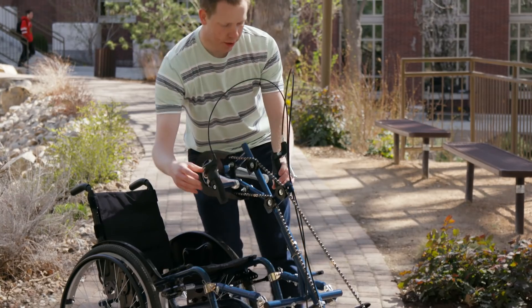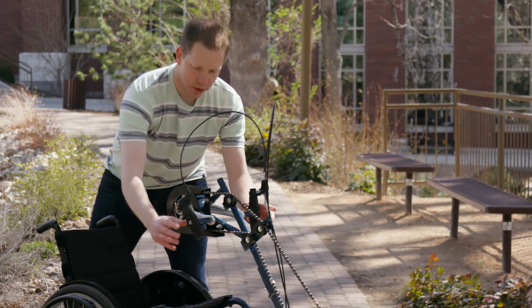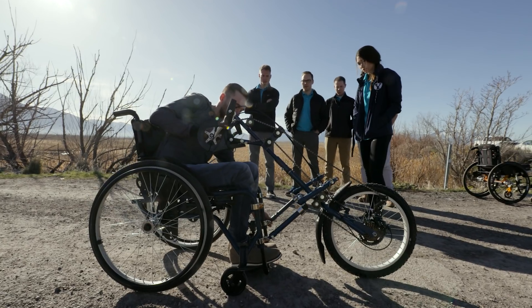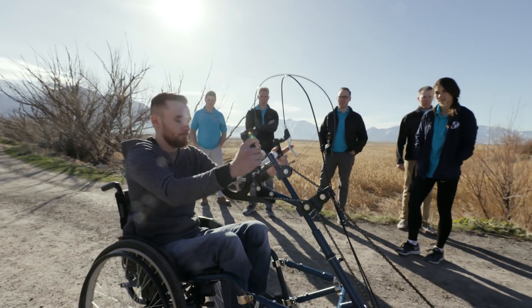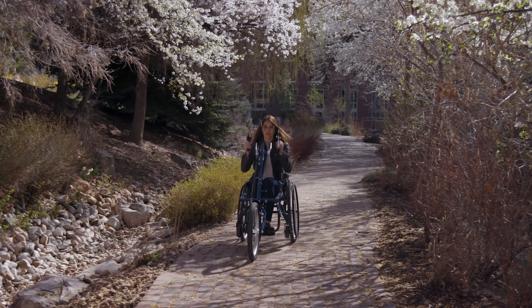You have your shifter and your brake right here, so while you're pedaling you can steer, shift, and brake all at once. There are seven different gears that users can utilize — starting out on rougher terrain is very easy, and as they get going they can reach up to 12–14 miles an hour on this thing.